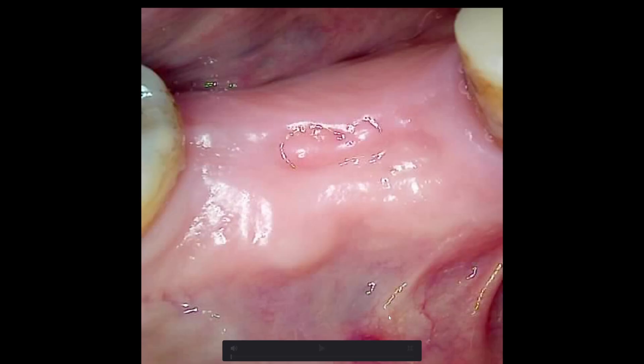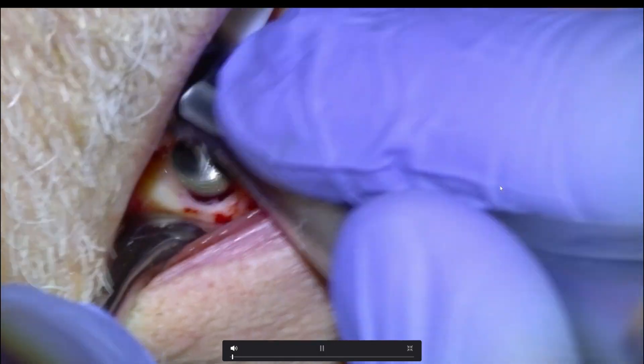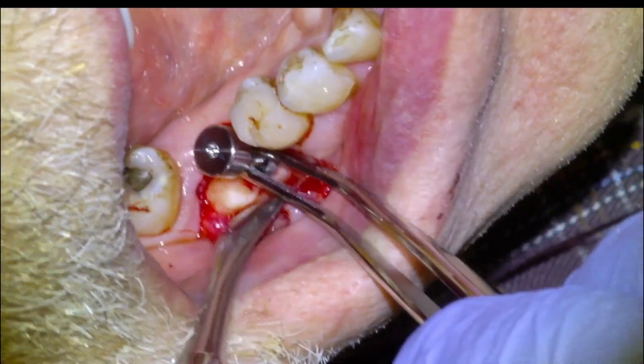Hey guys, I'm Dr. Dobson and we're going to be doing a dental implant surgery in the 4-6 site in this video. Here's an overview of what we'll be getting into: we'll anesthetize, punch, flap, osteotomy, profile, place the implant, and then close up.